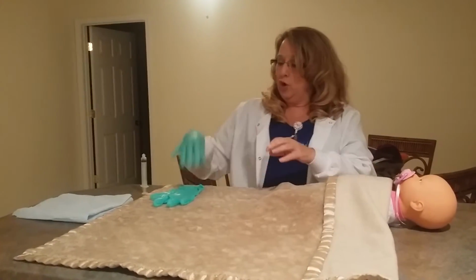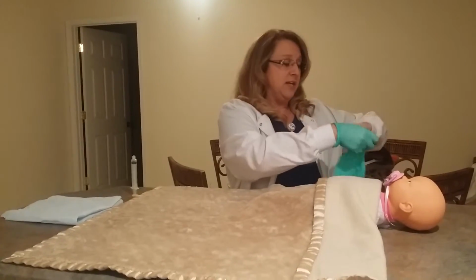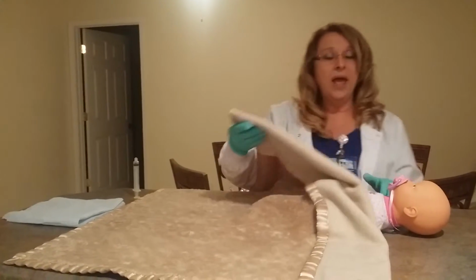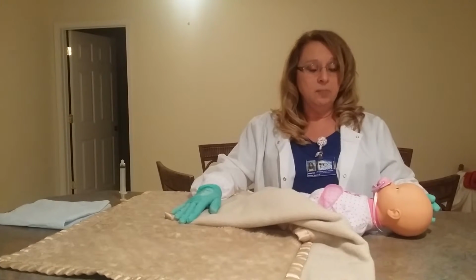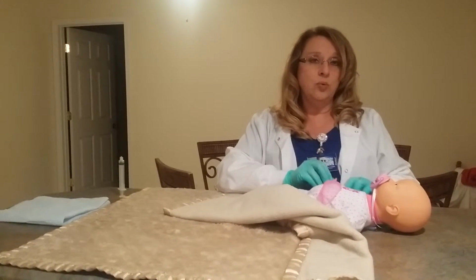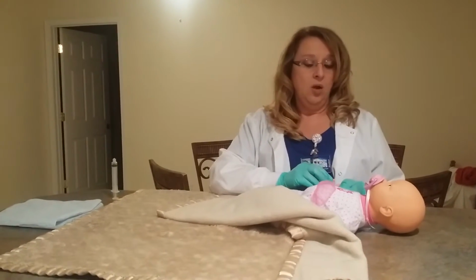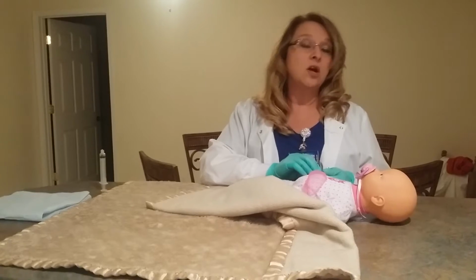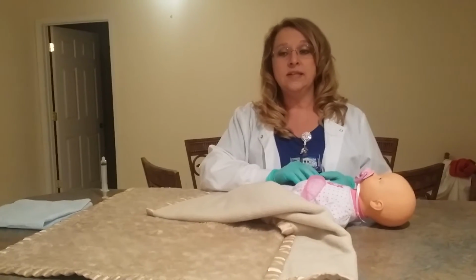We're now going to confirm the correct patient's identity by checking two identifiers. We will ask the patient for their name and date of birth, check this against their wristband. We have previously verified the doctor's order for discontinuation of the Foley, as a doctor's order is necessary to take the Foley out.